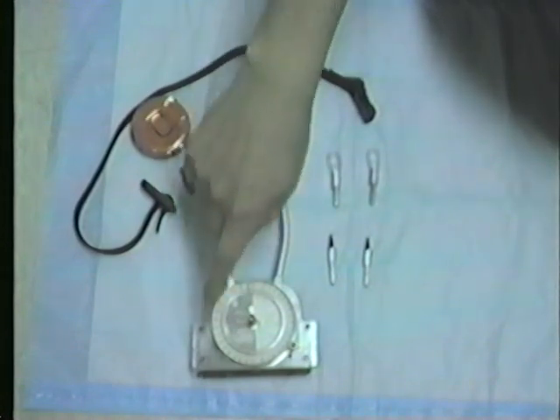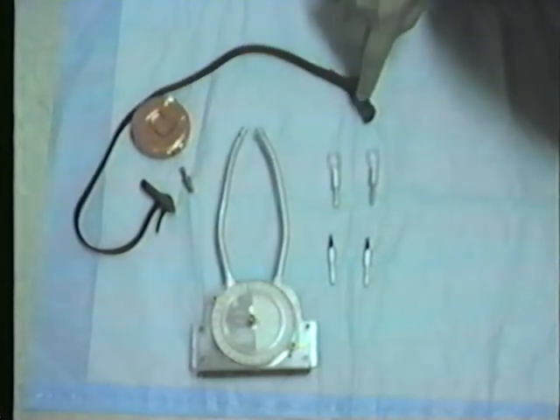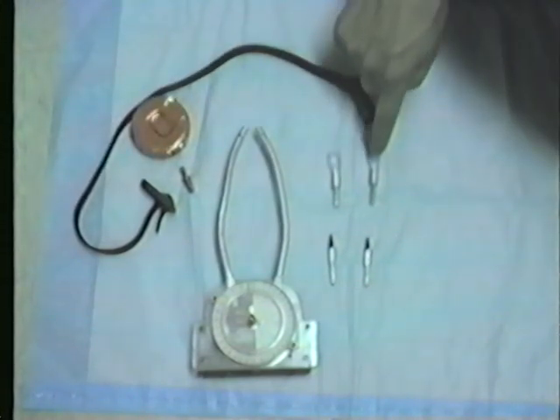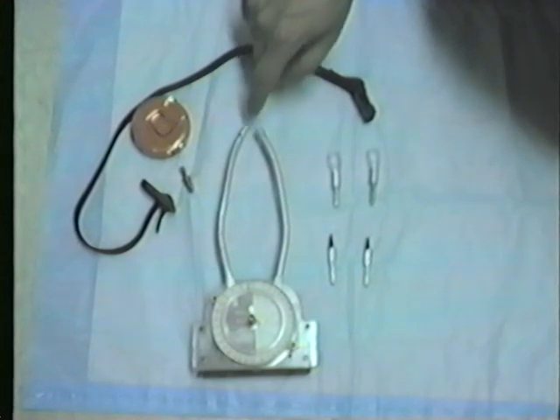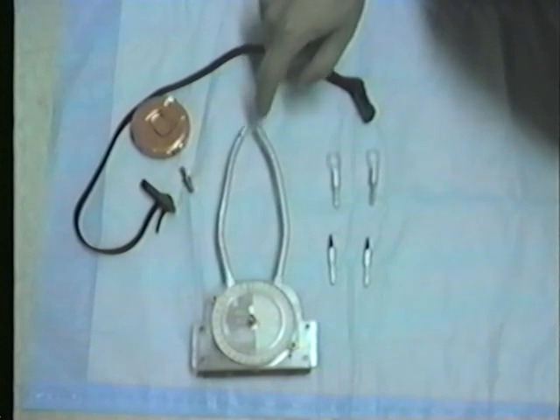Here you see the tool by itself, the suspension apparatus that is used to suspend it around the examiner's neck, two palpation ends that fit into the end of the measuring arms right here, and two pointed ends that fit into the same arms.